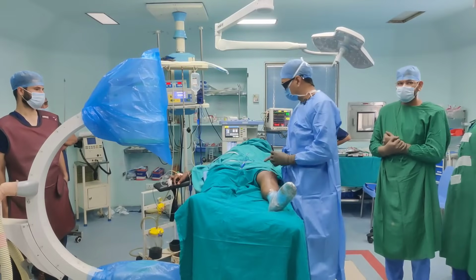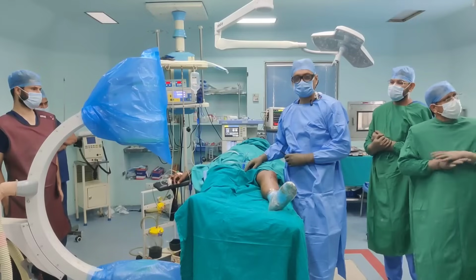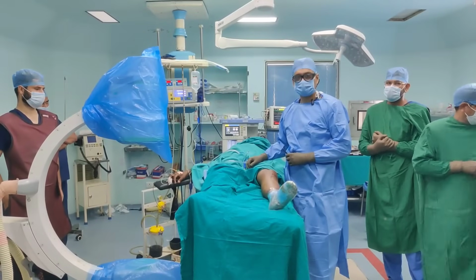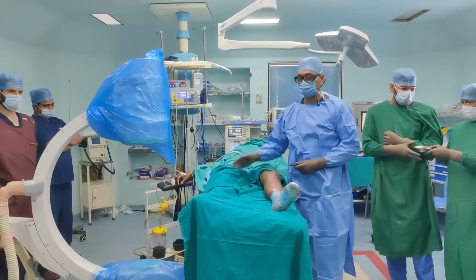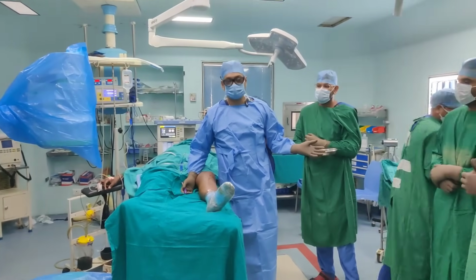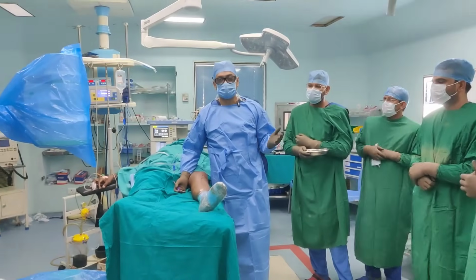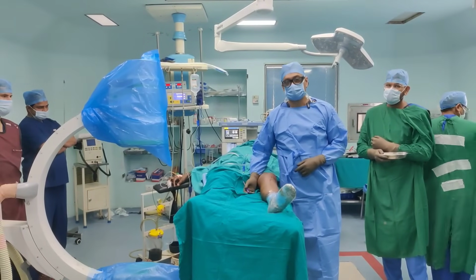So patient is supine, we have applied a tourniquet. I think there's no real disadvantage, but there are a lot of advantages of using a tourniquet. Patient is lying supine. The C-arm is going to come from the other side. I am going to stand on this side. My trolley is going to be on this side, and this is my theatre setup. Now the next step will be to show you the skin markings for this approach.